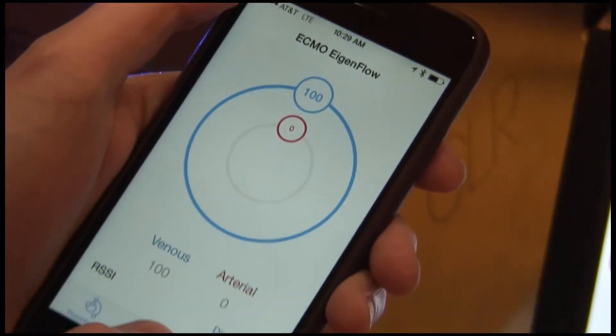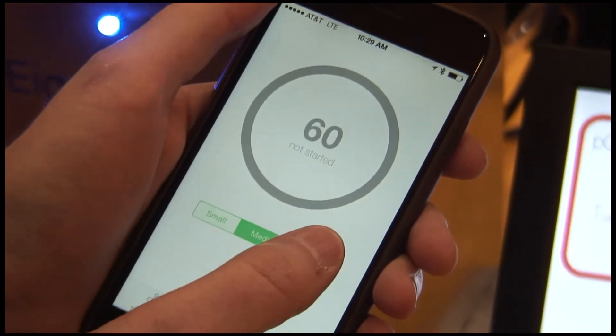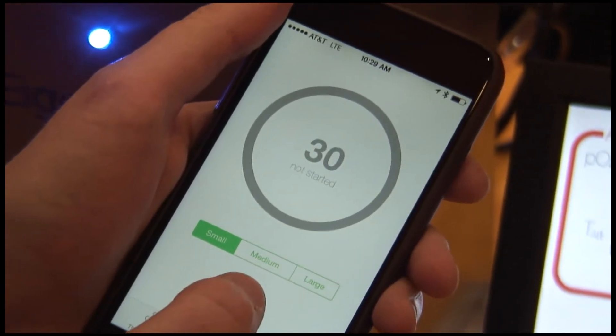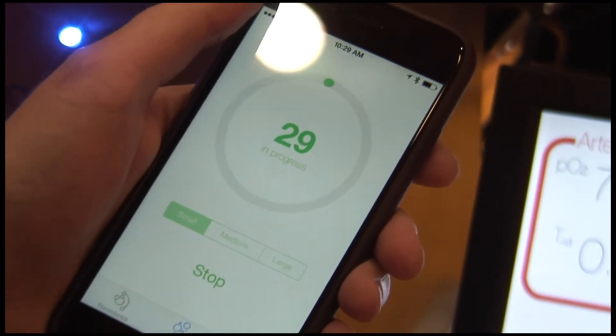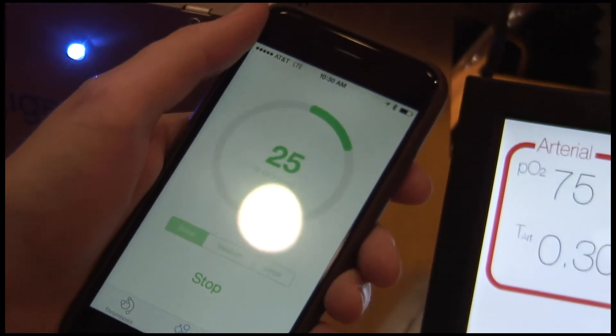We can also move over to the embolism tab and select small, medium, or large for the size of an air embolism. We can select small and it gives you 30 seconds of creating an air bubble that is put into the system.